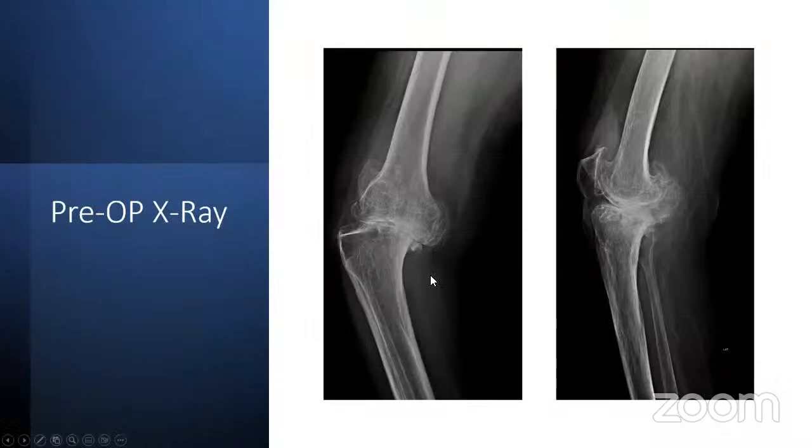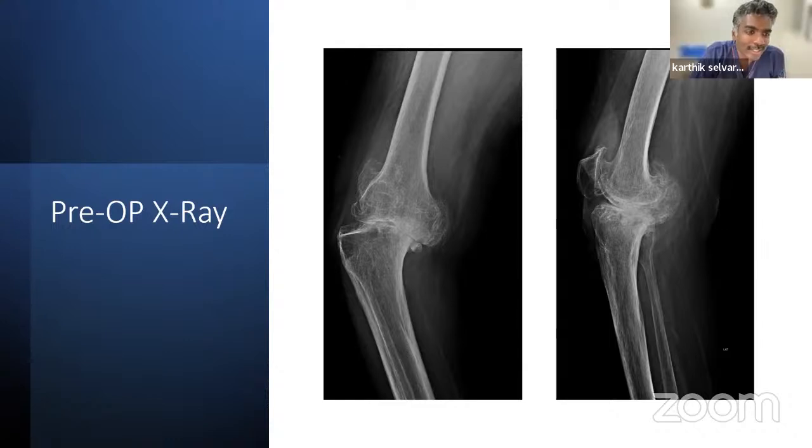So this is the preoperative X-ray, which shows significant varus deformity with lateral subluxation, with significant patellofemoral osteophytes and medial osteophytes and posterior osteophytes. Satish sir, how will you address this case? See, the enormous posterior osteophytes suggest that there will not be any problem in the flexion deformity, right? So it is basically the varus thing. Again, medially also there seems to be a lot of deformity. So once you remove the osteophytes, the deformity can be well corrected, but there is a lot of lateral subluxation.